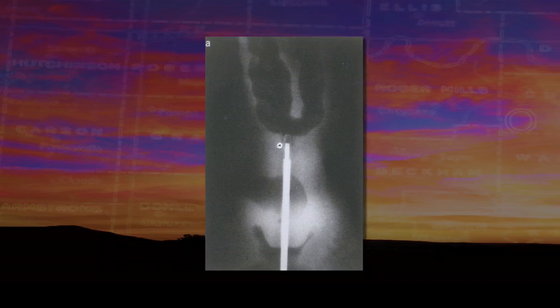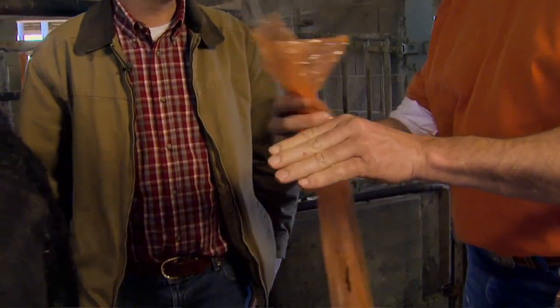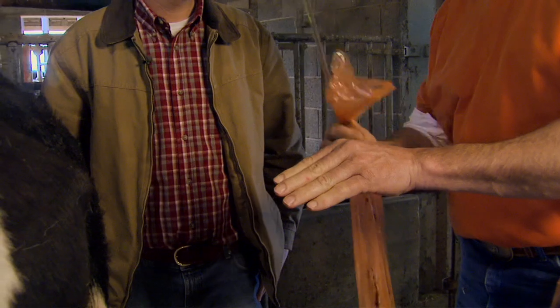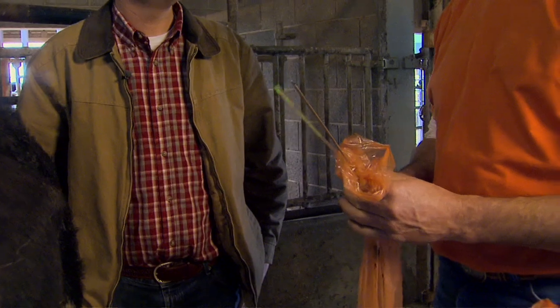I've heard some guys talk about breeding really young cows — a lot of times they'll try to clamp down on your arm as you're working in there. When you go in the cow, I try to go in with my fingers closed like that, and that cow's going to try to force you out. Just let her work over your hand and don't force your way in. Go slow — a steady pressure will get you there. Just be real nice and gentle and work your way through it.